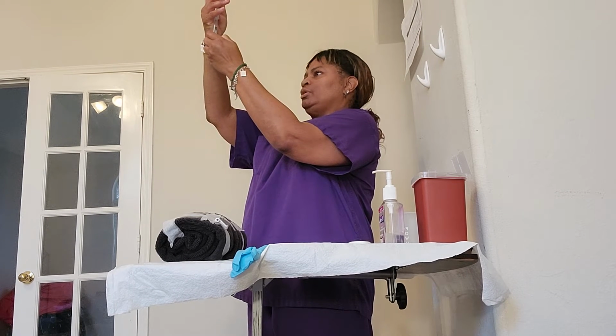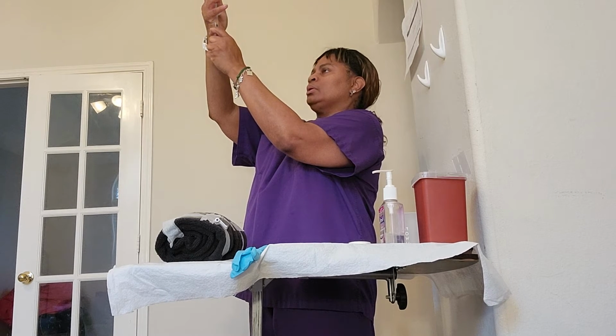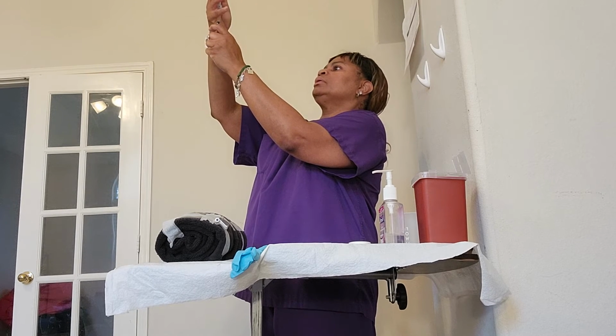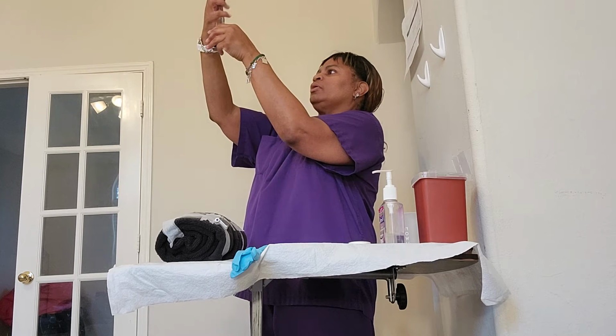I'm going to make sure that there are no bubbles in my syringe, and there are not.